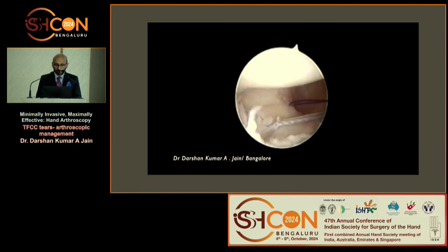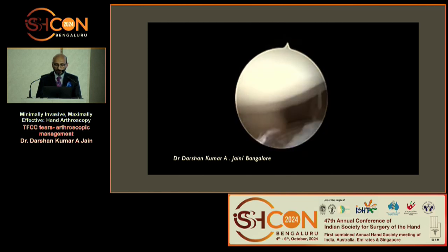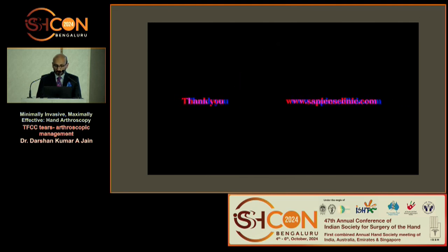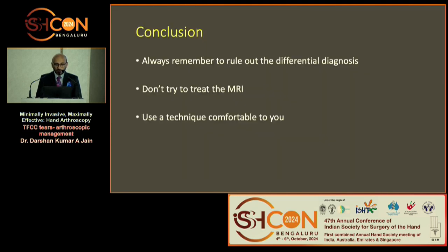You use fiber wire, as well as a dorsal capsular repair, you do that. Always remember to rule out the other differential diagnoses of these TFCC injuries. Don't try to treat the MRI. Many of these MRIs are falsely reported as TFCC tear. Use a technique which is comfortable to you.